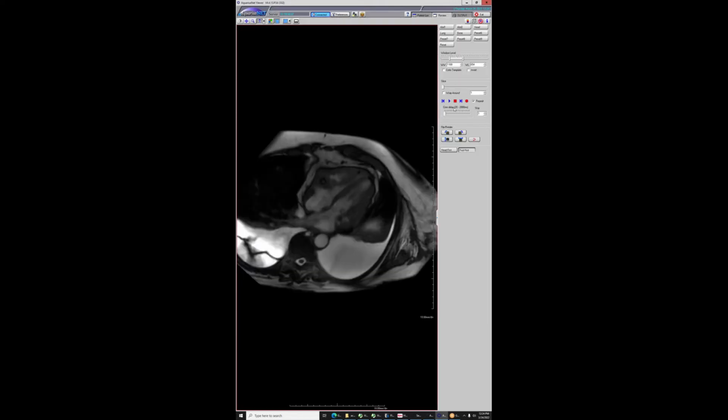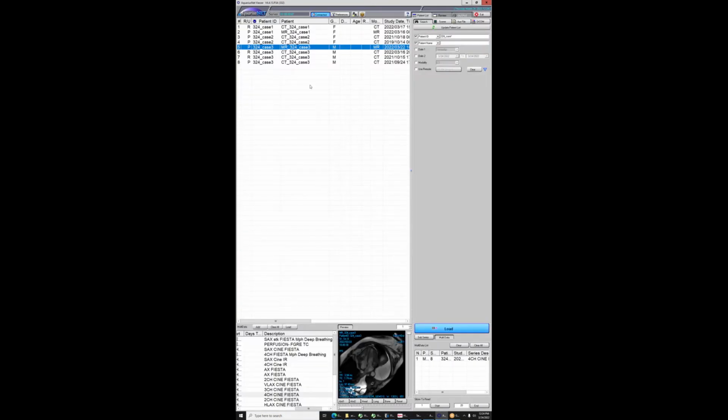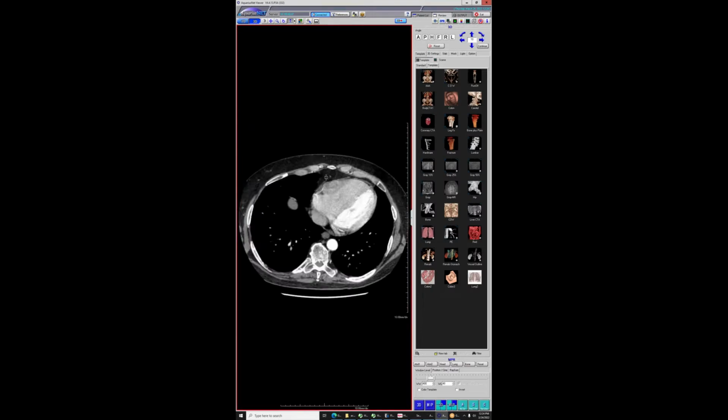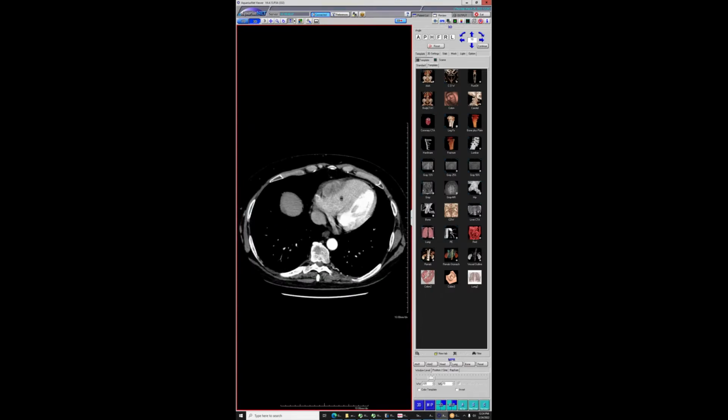So I'm telling them it's going to be a metastatic squame, and they're kind of saying, well, that doesn't happen. You don't get these. And I was like, well, we have a couple cases from here, but I don't know. The other thing you could think of theoretically was a pericardial meso, which is a good look for this, but the only thing that doesn't go with that is it's super rare and he has a history of a squame. And the other thing is that we have older studies which show a clear, in my mind, a clear cardiac mass in the RV at some point.